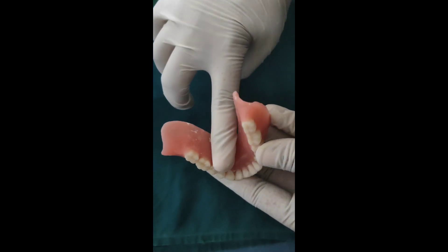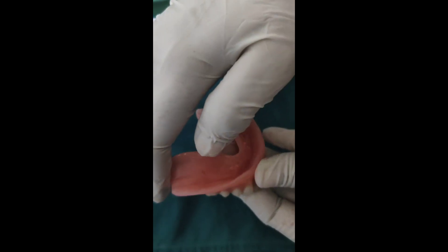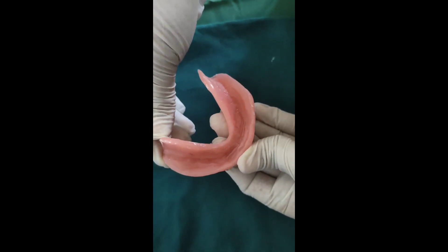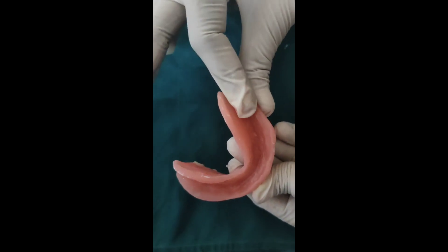The mandibular complete denture should be evaluated the same as the maxillary complete denture, and it should be checked for any irregularities or nodules present. If there are any irregularities or nodules present on the intaglio surface of the denture, it will lead to irritation of the tissue.